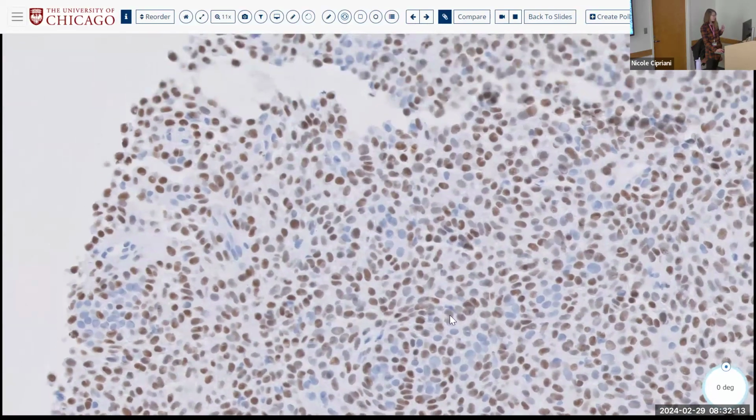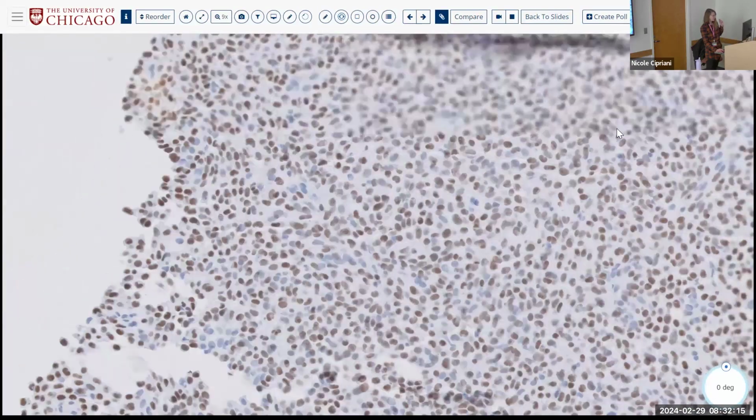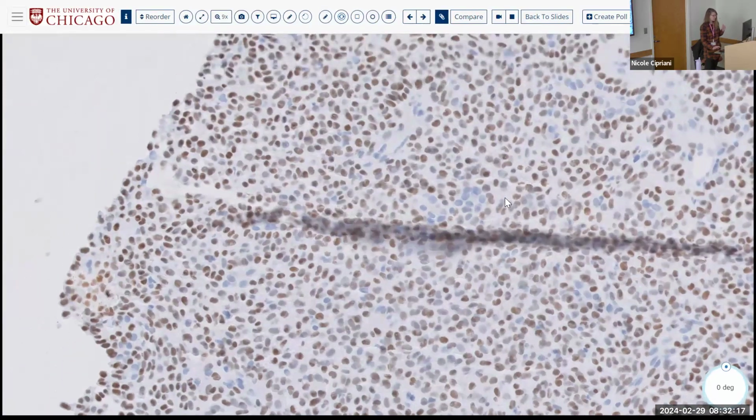The thing that I am very critical about in interpretation and reporting of salivary gland immunohistochemical stains, which I sometimes see poorly done from consulting institutions, is just to say that this is P63 or P40 positive. Well, yes, but you really have to subtly notice whether there is any negative cell population, and if that negative cell population is architecturally or structurally different, right?